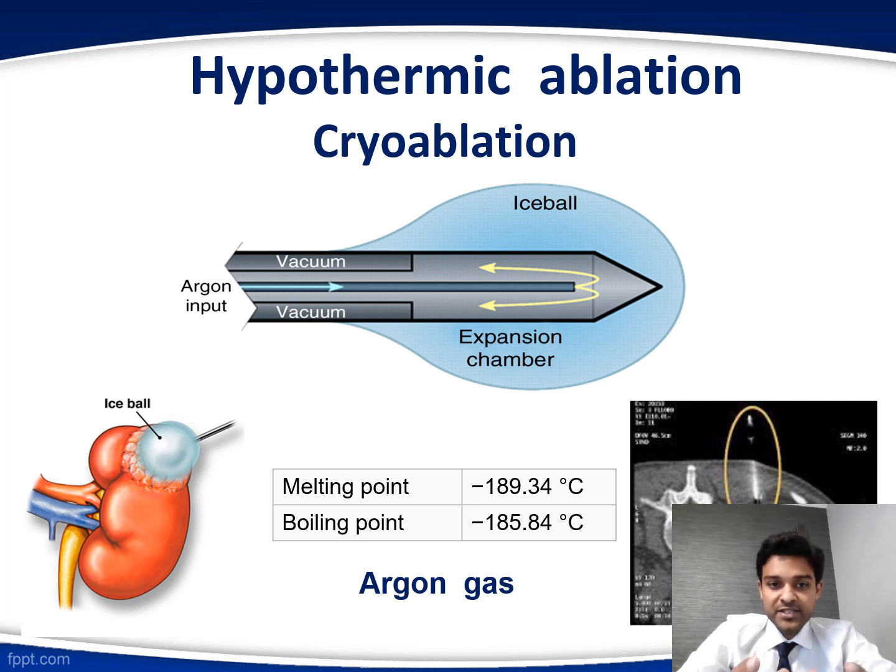So my next topic is hypothermic ablation. Underneath that we have cryoablation. Now cryoablation is also called cryotherapy or cryosurgery. It's a form of treatment that uses extreme cold to freeze and destroy cells, including tumors.